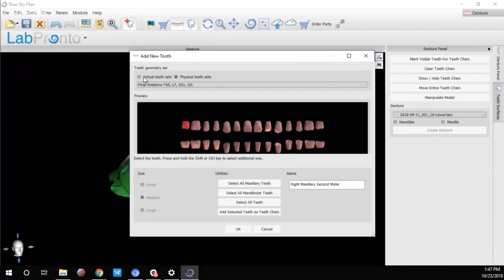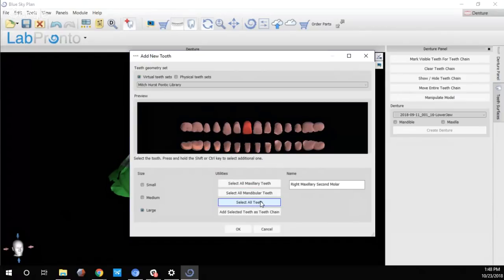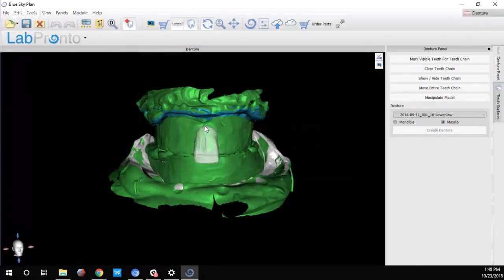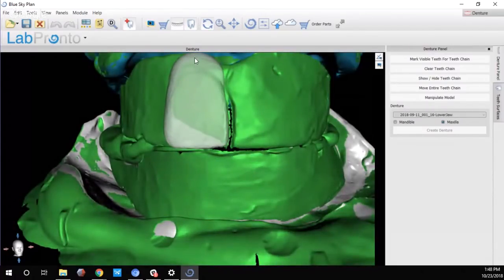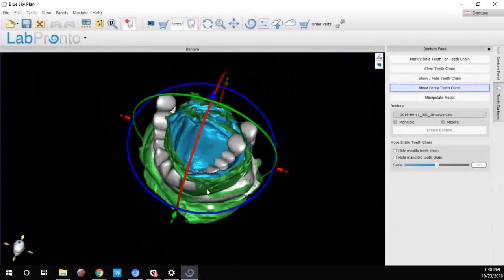I selected all teeth and clicked Add Selected Teeth as a Teeth Chain. I'll zoom in, select the anchor location, and shift+left-click to place the library — the computer will process and place the teeth chain. Next, I'll right-click on the bite rim model and toggle transparency. This lets me navigate through the bite rim as a reference to position the teeth accurately. Using the scaling feature, I can adjust the teeth to the desired size, and the widget allows me to move the entire teeth chain for both maxillary and mandibular anatomy.